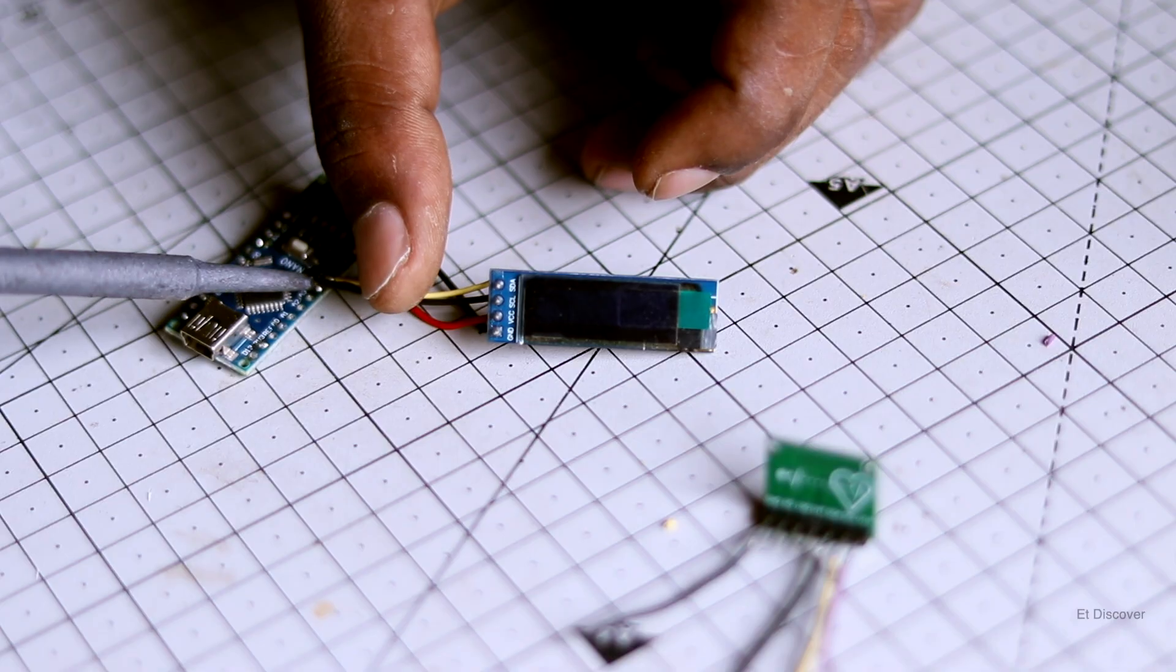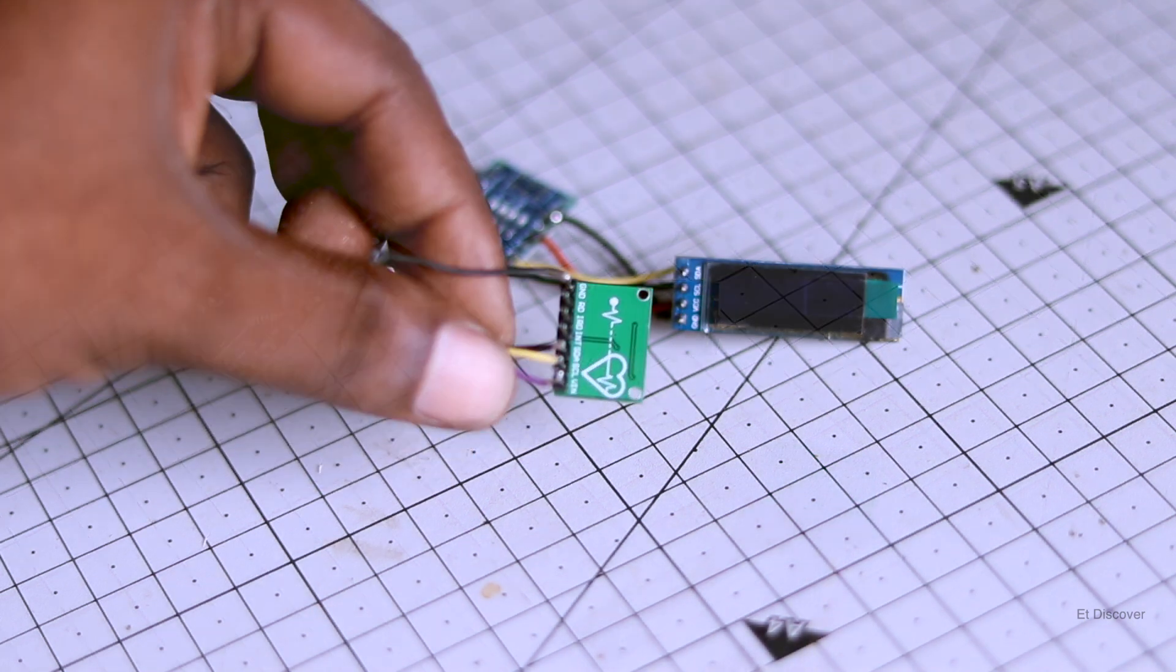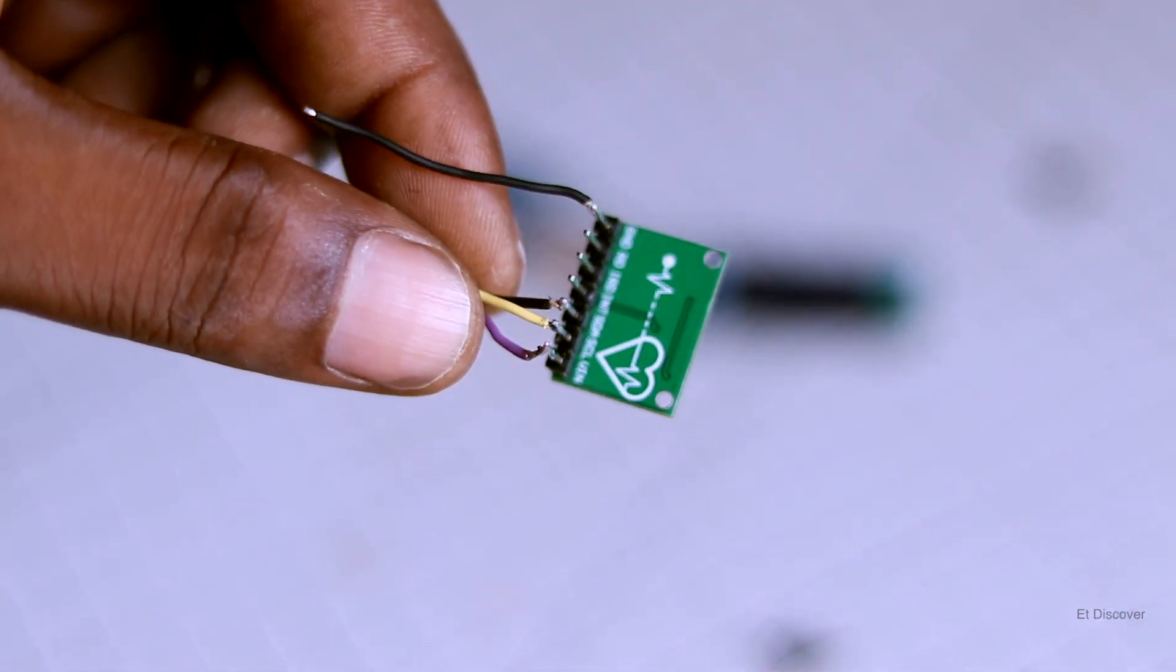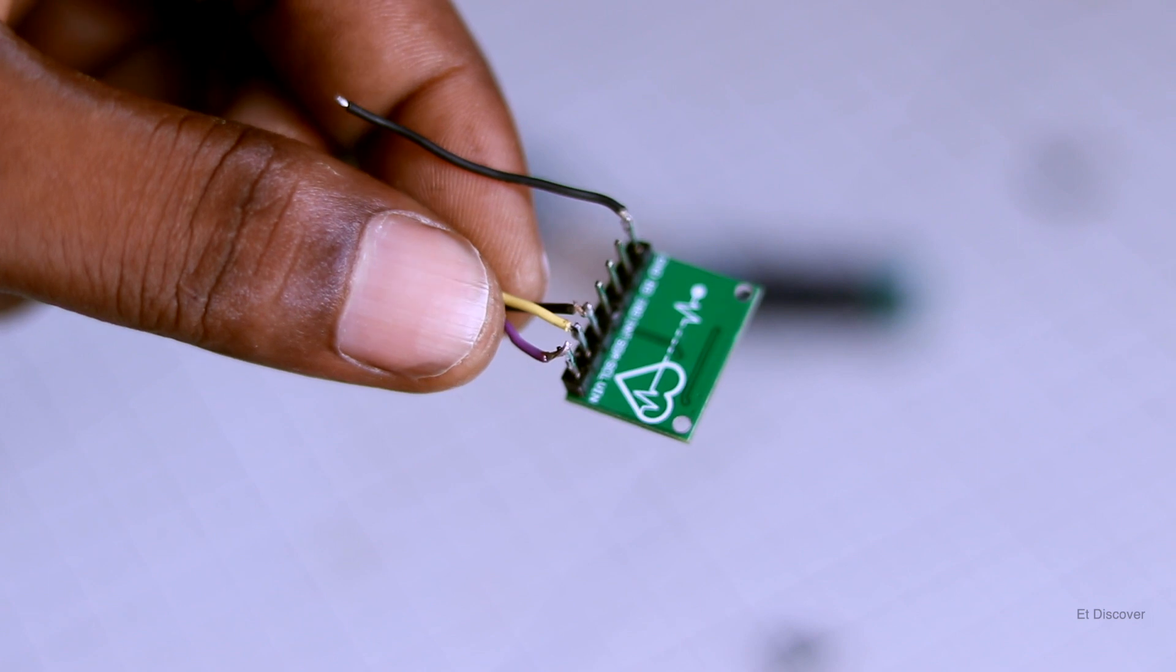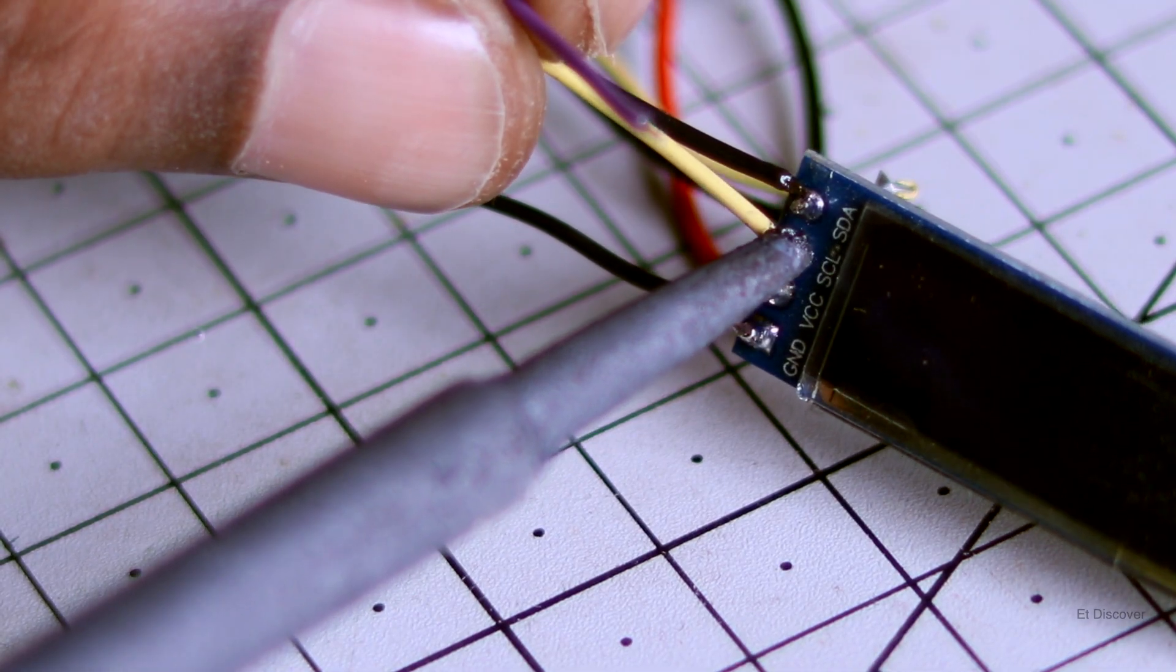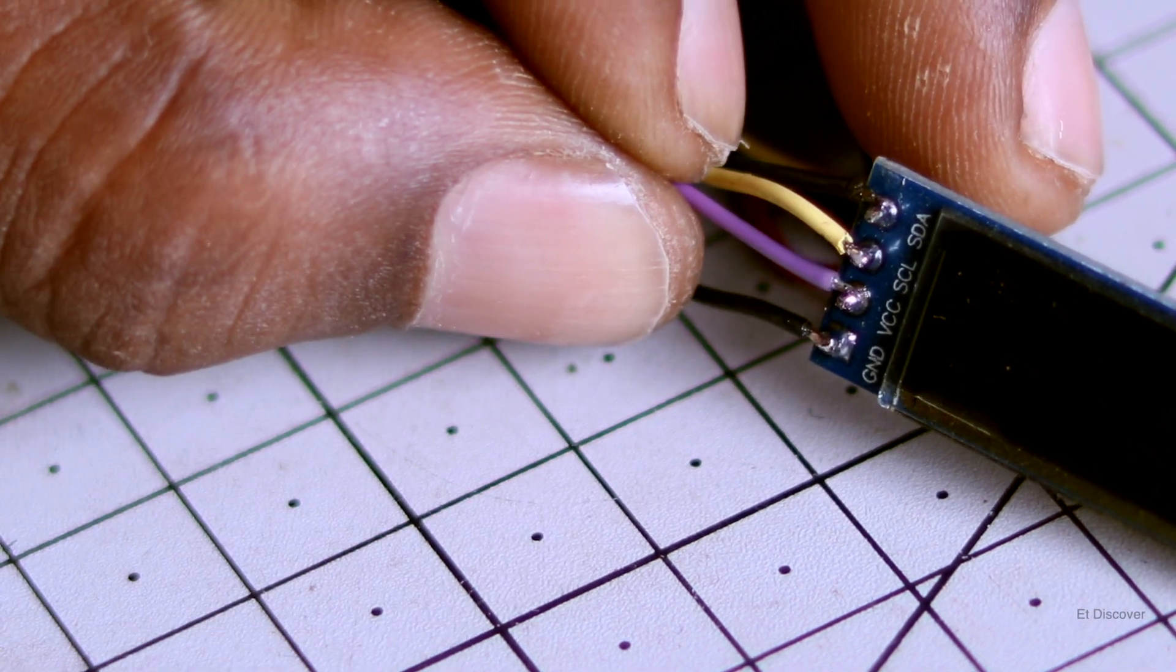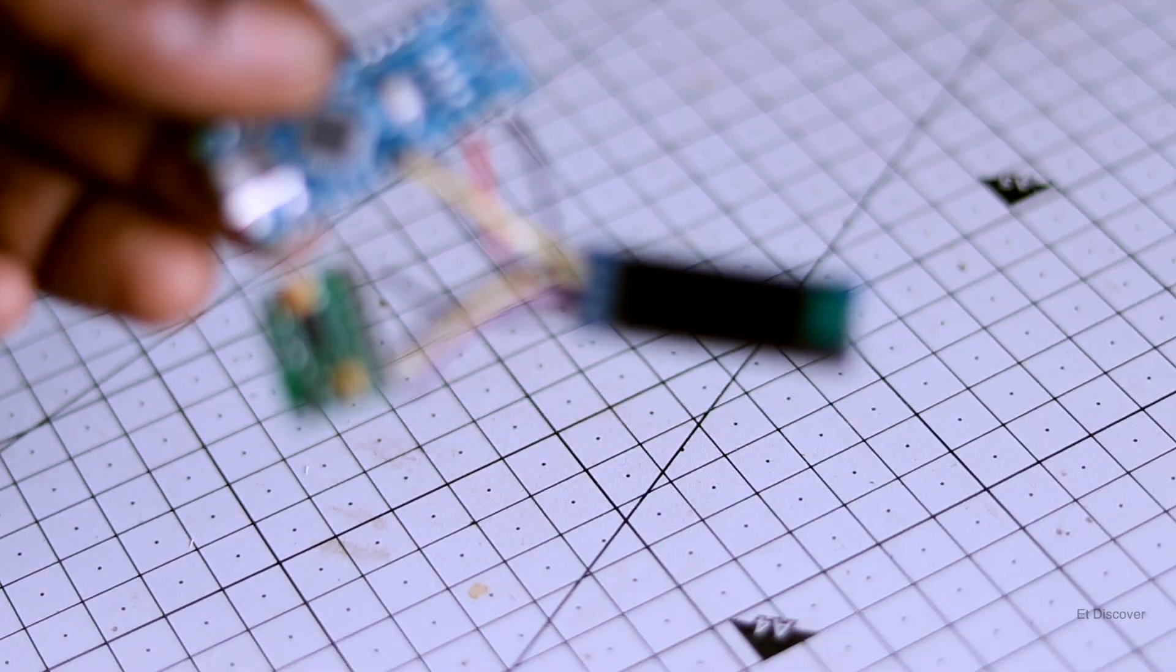So I connect my OLED display with my Arduino Nano. And here you can see, MAX30100 heart rate sensor module. This sensor measures your heartbeat and your body's oxygen level. So I connect this sensor with my OLED display because both are running in I2C interface. So finally you can see our connection is done.